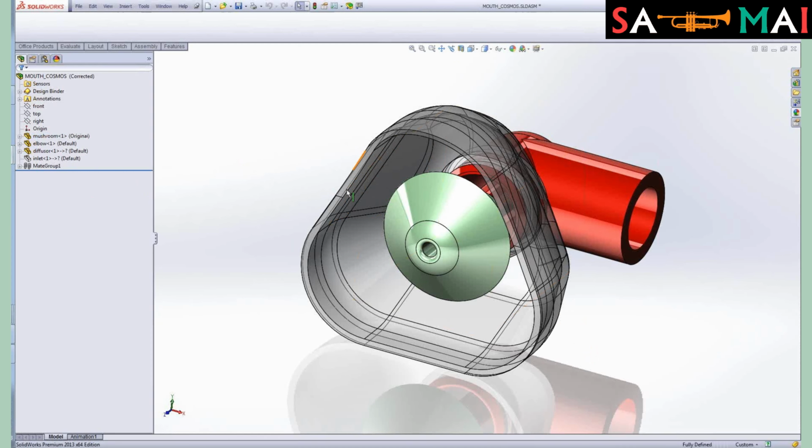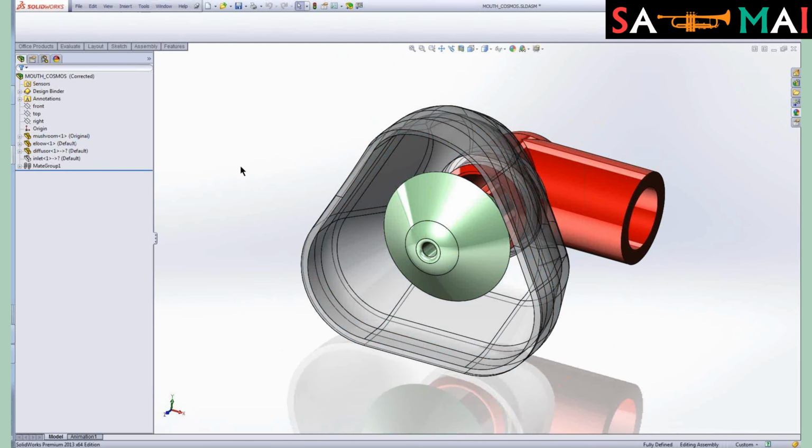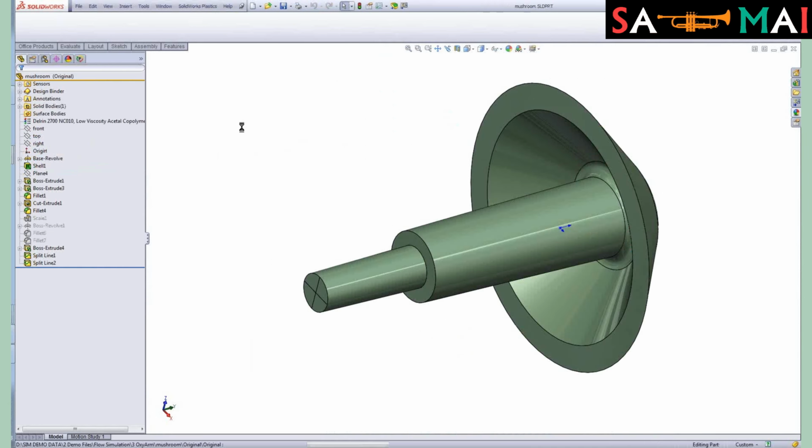So the mushroom, that's the first part that we're going to look at, is this component here that I'll highlight there in blue. And that's what we're going to do our first look at SolidWorks Plastics with, just the capabilities of Plastics Professional. And then after we've gone through that, we'll analyze the diffuser. So let's go ahead and dig into this particular part here.